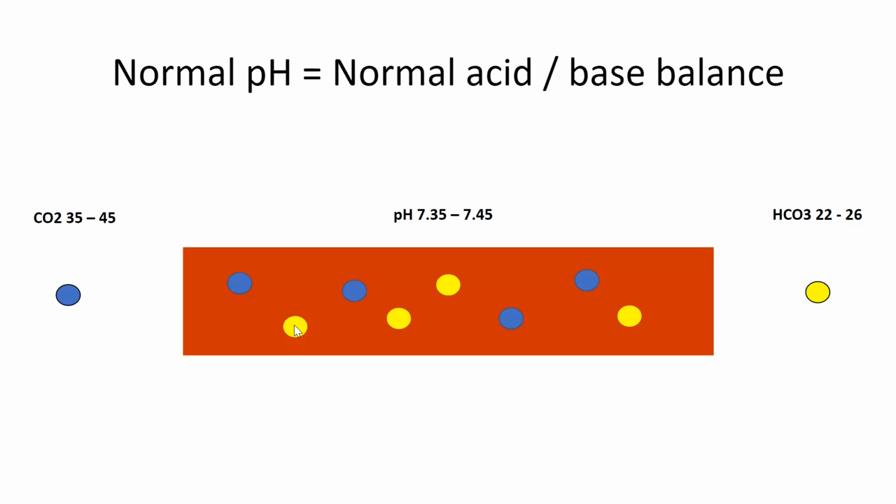On the next slide, I'm going to use some visual representation of CO2 and HCO3 to show compensation. This isn't exactly what's going on in the body, but you don't need to know exactly what's going on at the cellular level to understand pH balance and compensation. You can certainly research independently if you want a fuller description, but for our purposes, I'm taking some liberties with how things occur to provide you a basic understanding, which is really all you need.